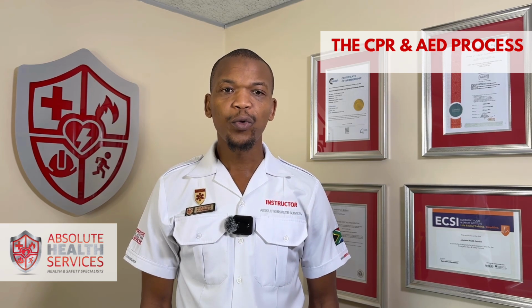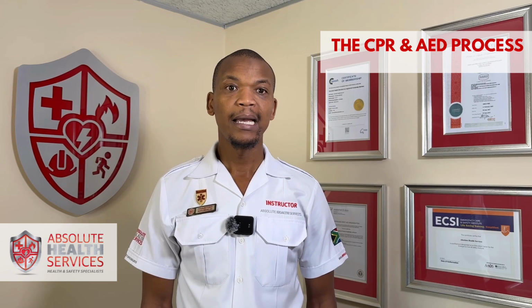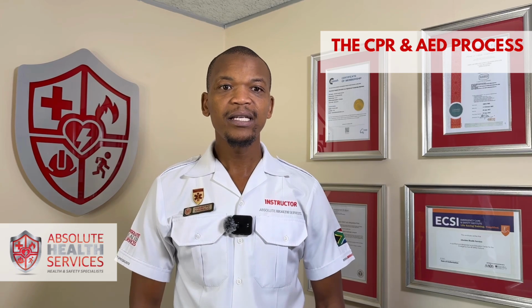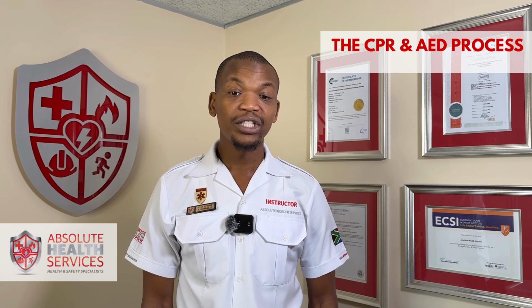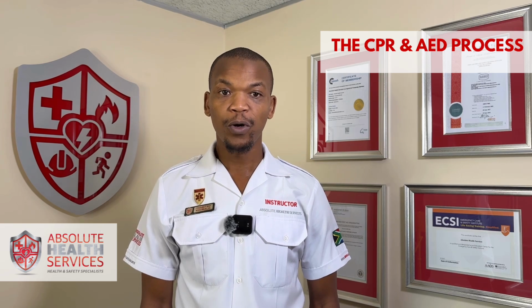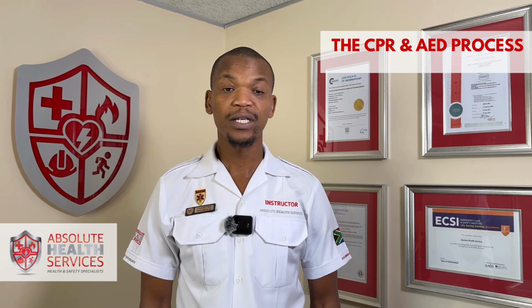You are then going to request somebody for help, who should call the ambulance and bring an AED machine. So when the AED arrives, you do not stop with your CPR. You continue with the compressions and the ventilations. The person arriving with an AED shall then switch it on and follow the voice prompts, which basically are to place the pads on the person's bare chest.